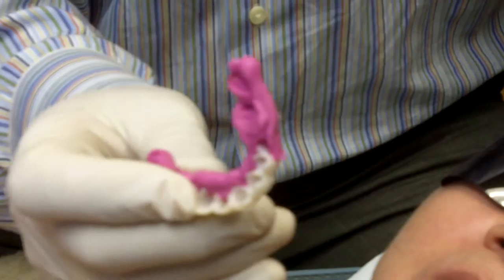We've been able to make sure we have enough clearance for everything in the back and we have a nice bite registration. We're going to have to make a whole new provisional, but the lab really likes this very accurate bite registration with the futar.